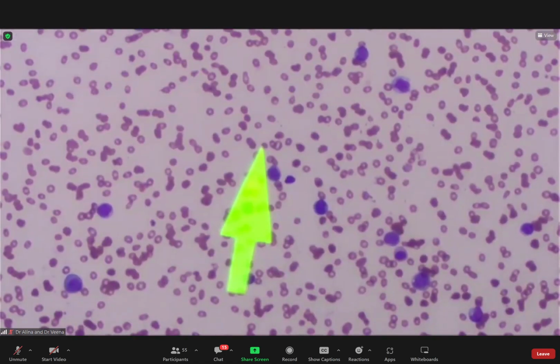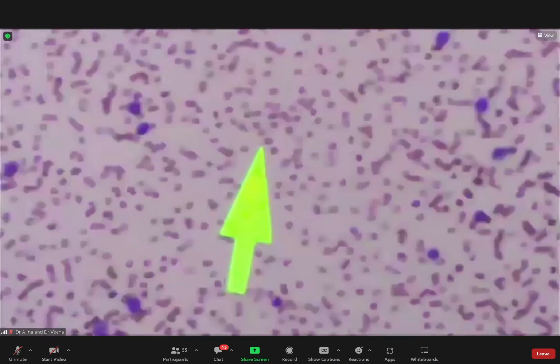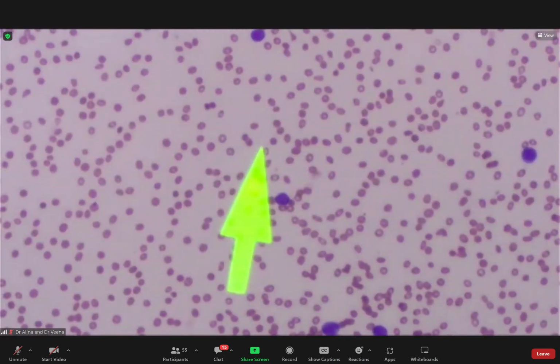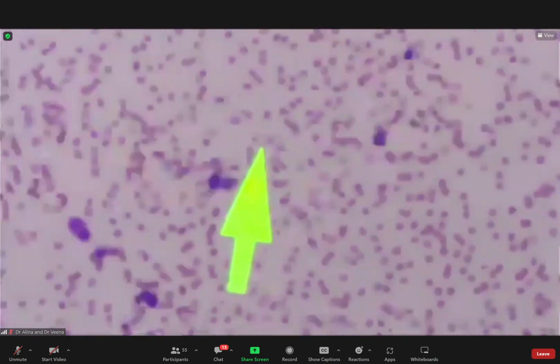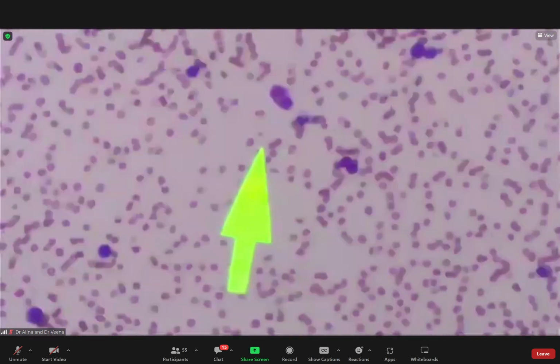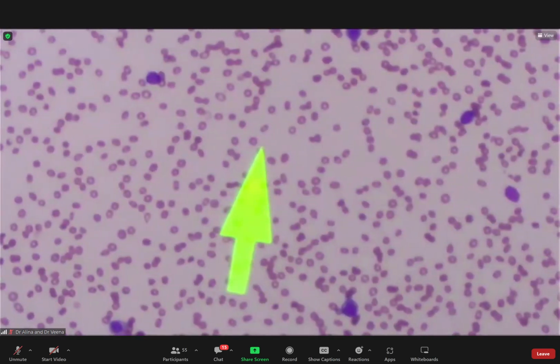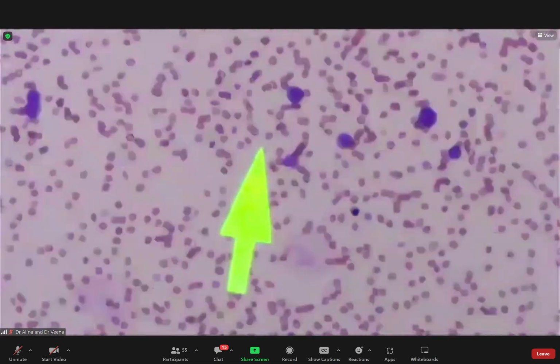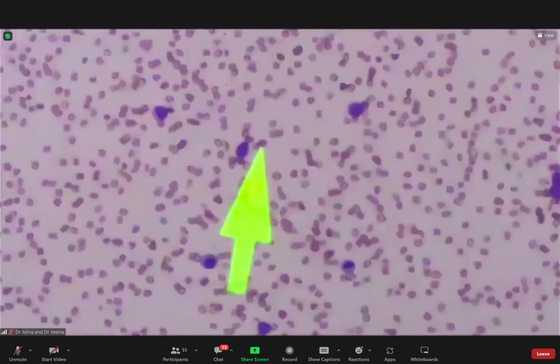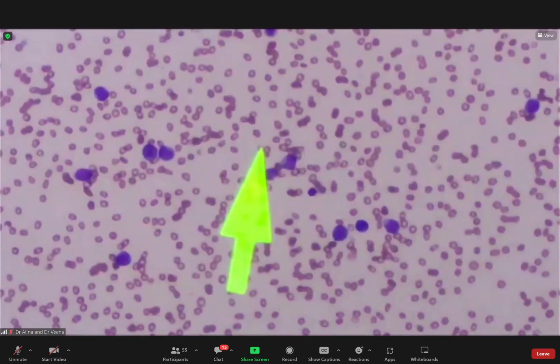The age is an elderly man. A bit of agglutination, and the red cells show a little bit of red cell agglutination and rouleau formation. You appreciate that? So all things considered, this is likely to be an LPD, okay? So if you answered along those lines, you would have gotten marks. But because the morphology is slightly blastic, this is likely a mantle cell LPD.